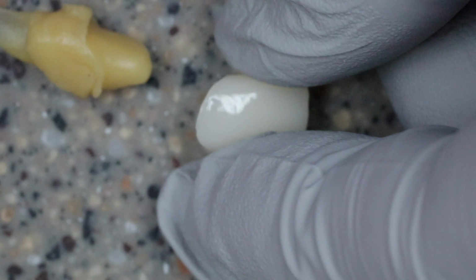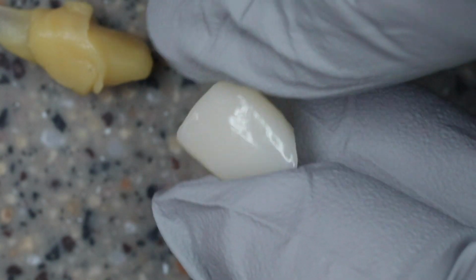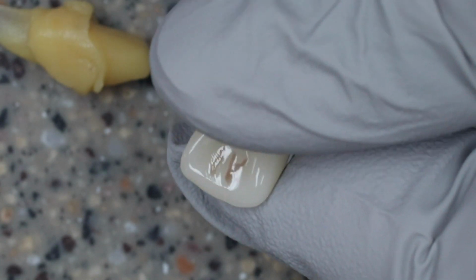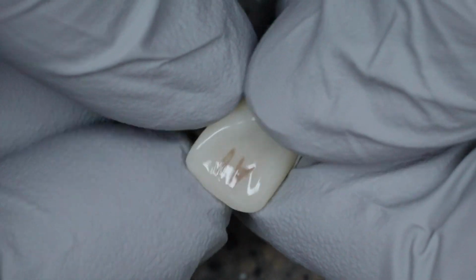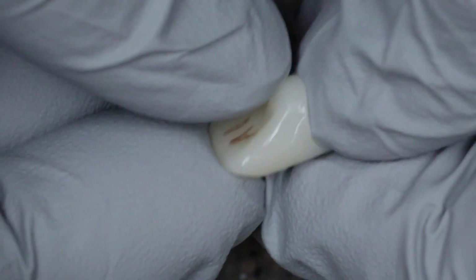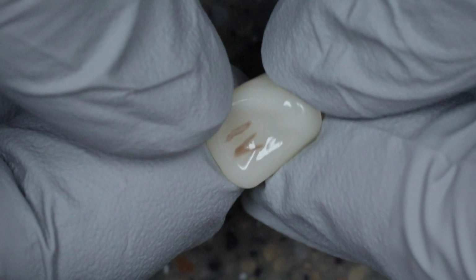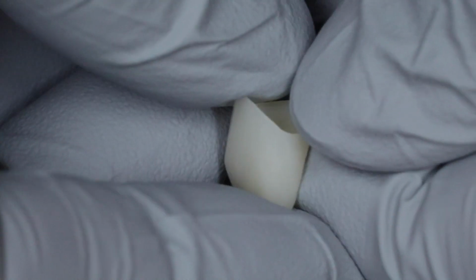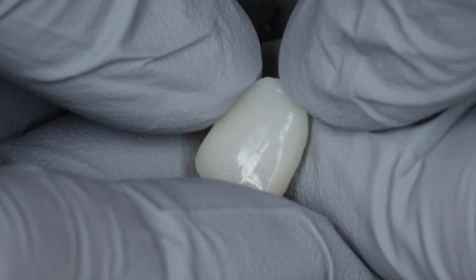So these are just some tips, things that I think come in handy. Hope you find this useful. We could do this for e.max, we could do this for Empress, we could do this for whatever material we use in the office. And again, how many shades do you want? That's up to you. I'm going to do some A shades, I'm going to do some B shades, and I'll start there, and then I'll see how it goes. I'll use this on some cases and make more if I need to, make adjustments if I need to, but this is the process I use to make a custom shade guide.